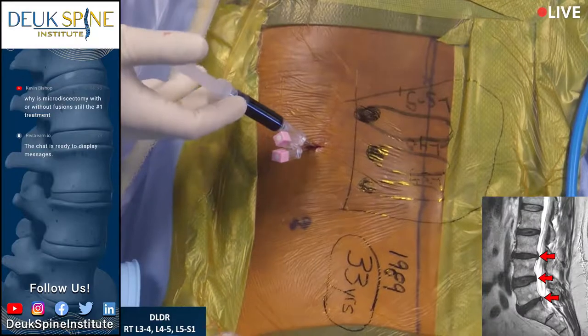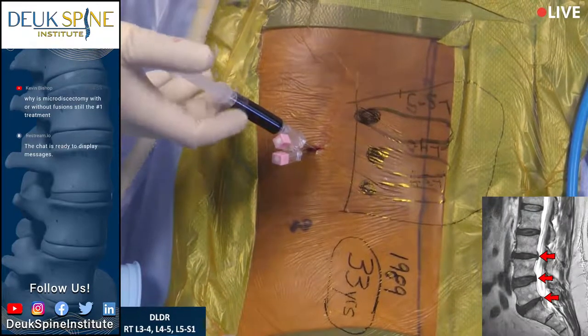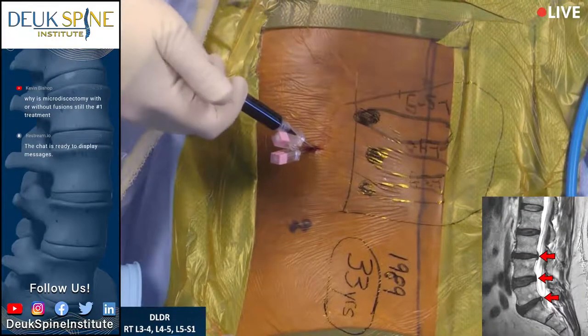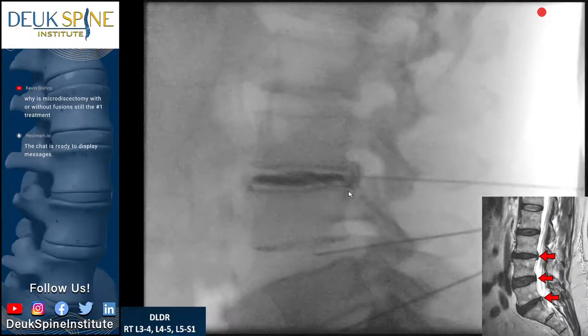Say it again, sir. Where the needle is. All right. Not bad? Not bad. All right. How bad is that on a scale of 1 to 10? 10 out of 10 pain. Okay, so you can see on the x-ray, we just tested the L3-4. And he called, is that where you typically get back pain? Yeah. Yep, concordant.